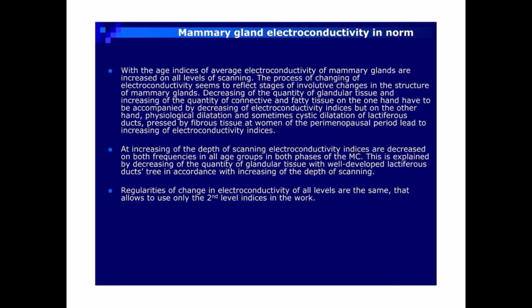With the age, indices of average electroconductivity of mammary glands are increased on all levels of scanning. The process of changing of electroconductivity seems to reflect stages of involutive changes in the structure of mammary glands.